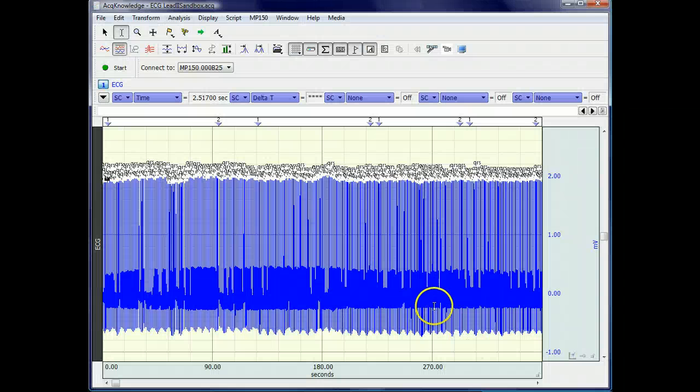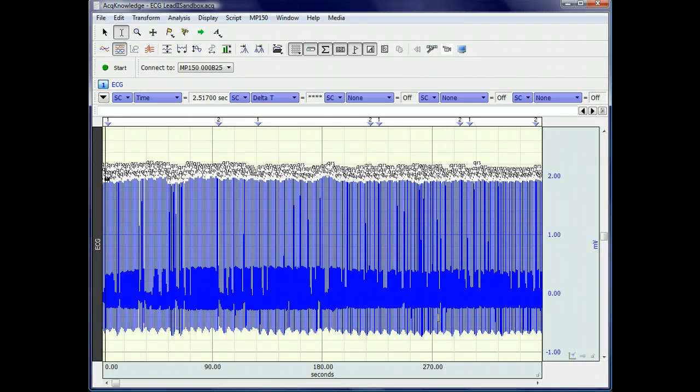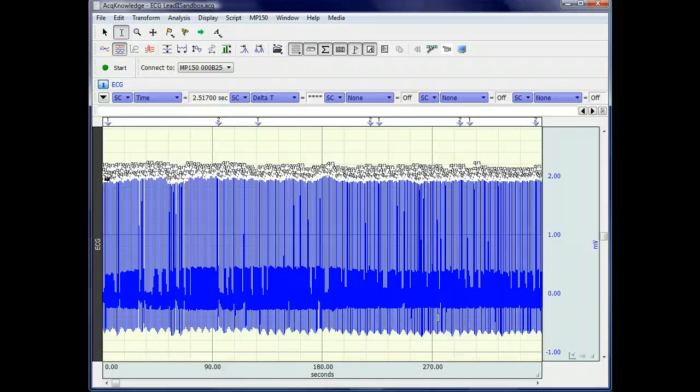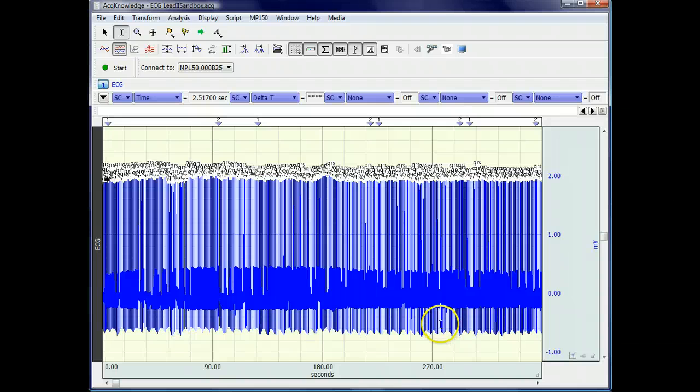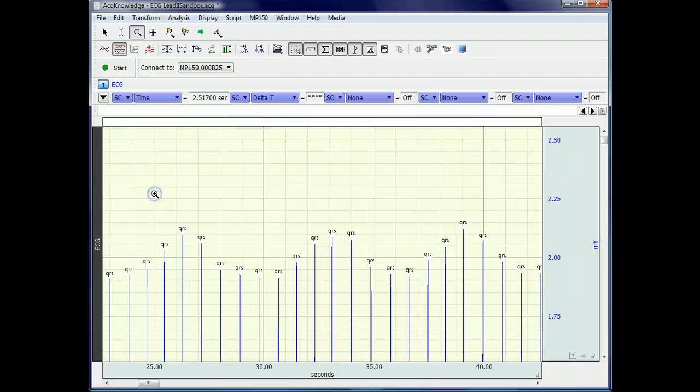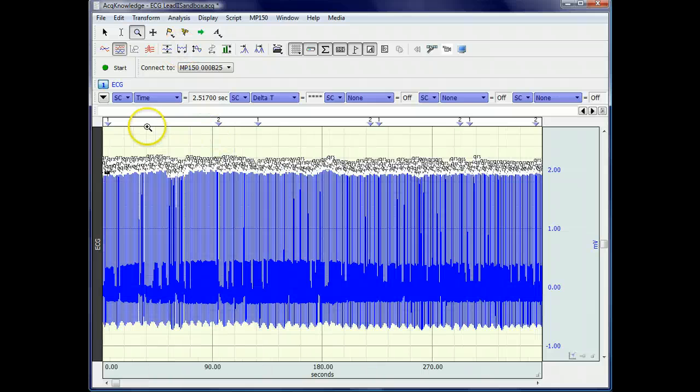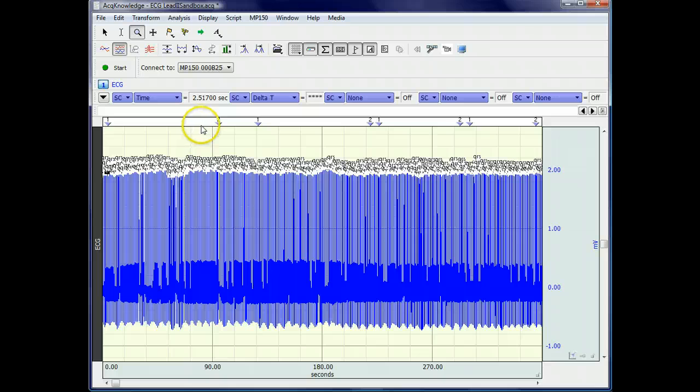Included with the zip file containing the script is a copy of the ECG Lead2 data from the sample data files that are included with ACKNLG 4.2. The file has been modified by the addition of QRS peak events, which were inserted via find cycle, and also with the addition of user-defined type 1 and type 2 events, just for the purposes of demonstrating what the script does.